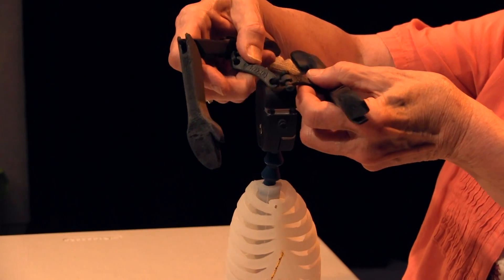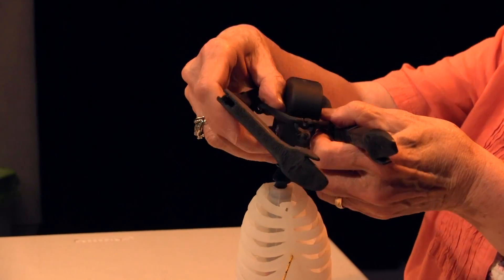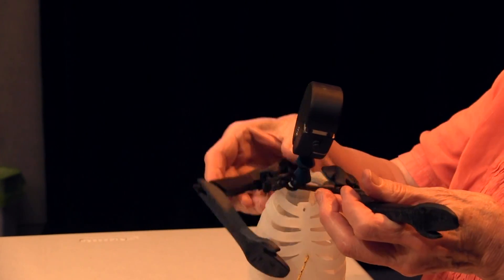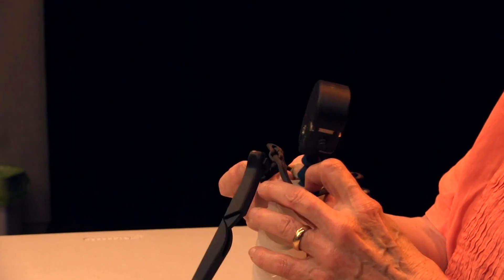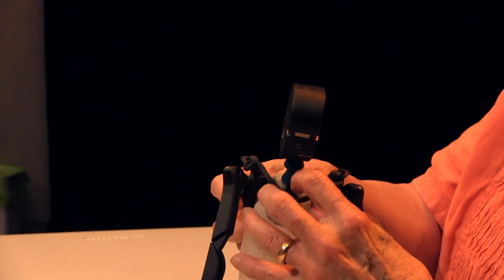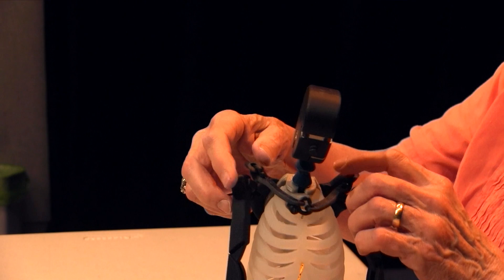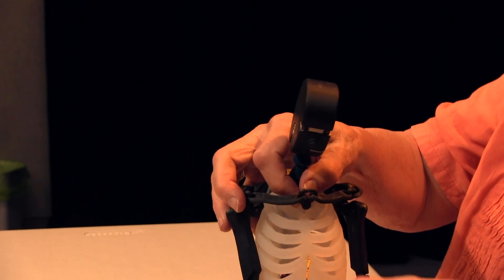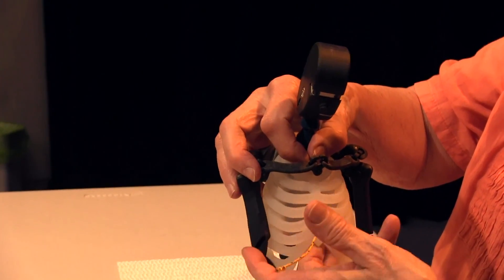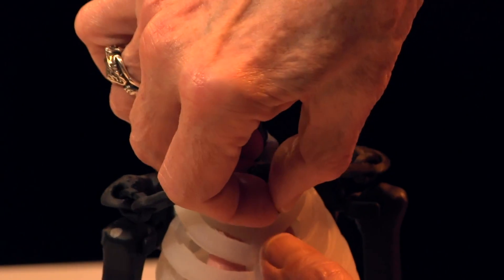Lower it and hook the back clip between the second and third bead of HAMI's neck. It will be resting on the top of the chest. For the front fastener, support the chest with two fingers and press the button into the hole at the top of the sternum.